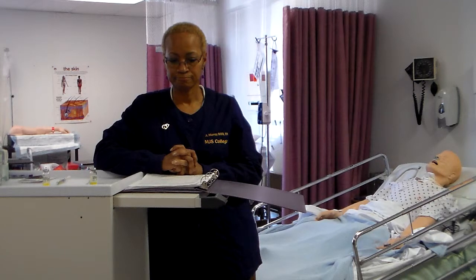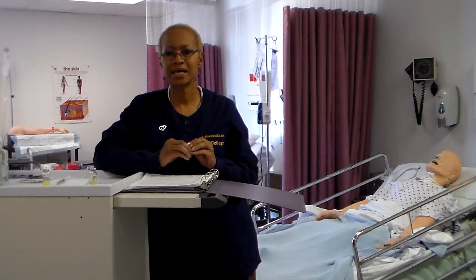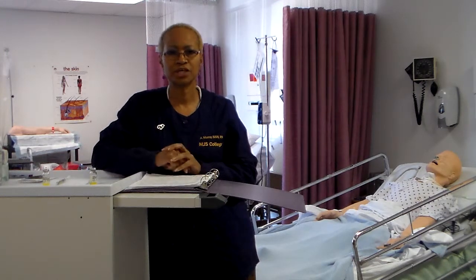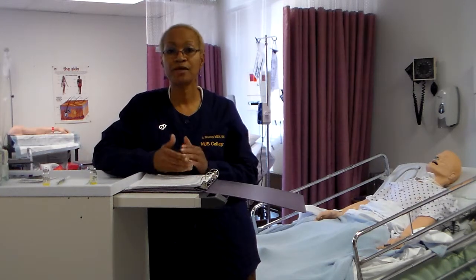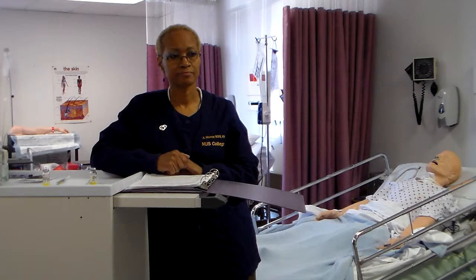1. For subcutaneous injections, assess for factors such as circulatory shock or reduced local tissue perfusion. Assess adequacy of client's adipose tissue. So remember, you're always going to make sure that you assess your client's sites before giving any injection, because that's going to determine how that medication is absorbed. 2. For intramuscular injections, assess for factors such as muscle atrophy, reduced blood flow, or circulatory shock. Correct. Check label of medication with the MAR.